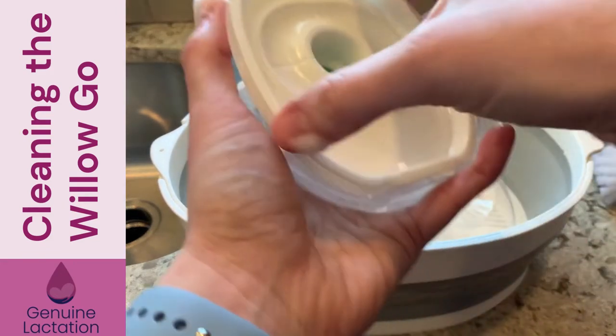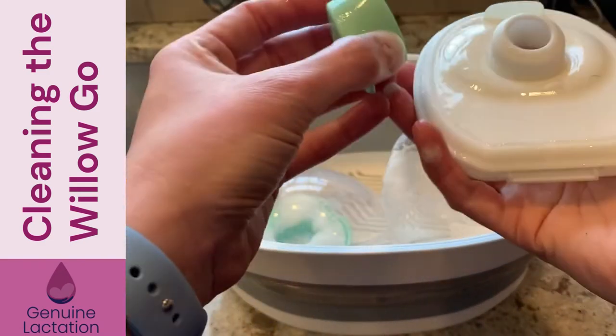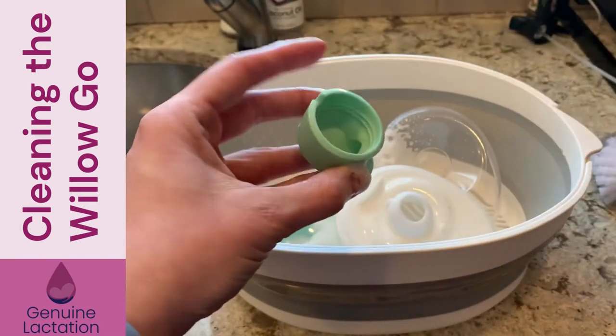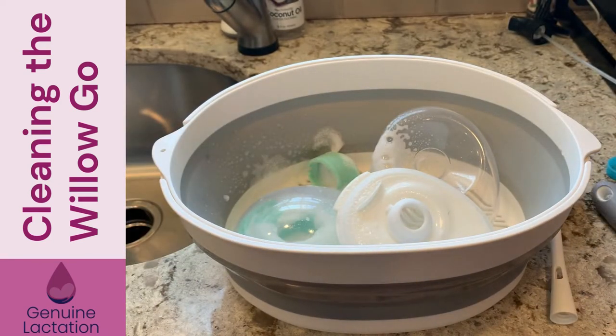Then you're going to take your milk container apart. Your plastic piece is good, and you've got your duck bill valve — that's the back of the container. Just spray this down and let it sit there for a couple minutes. Then you're going to do the second one the exact same way.